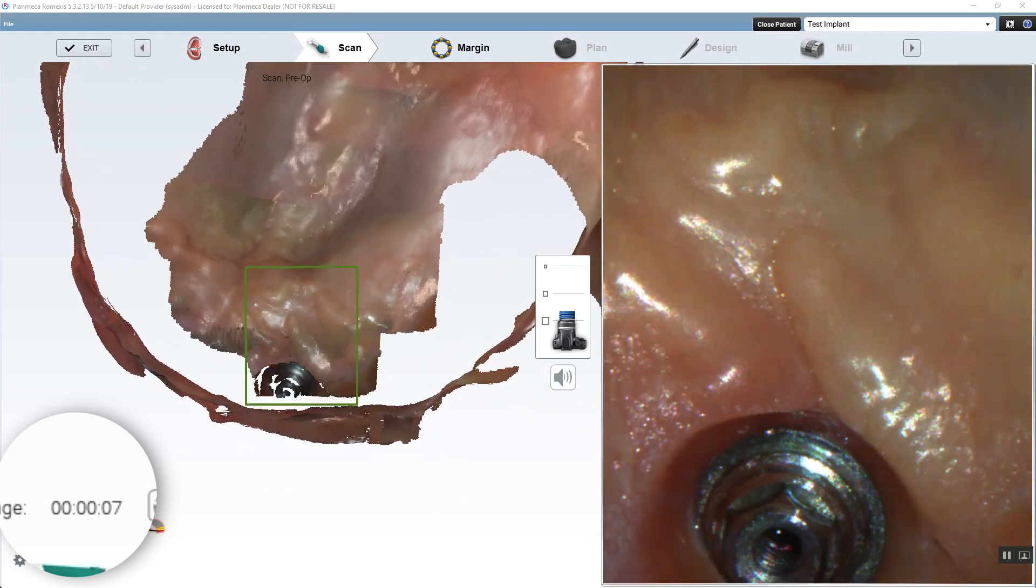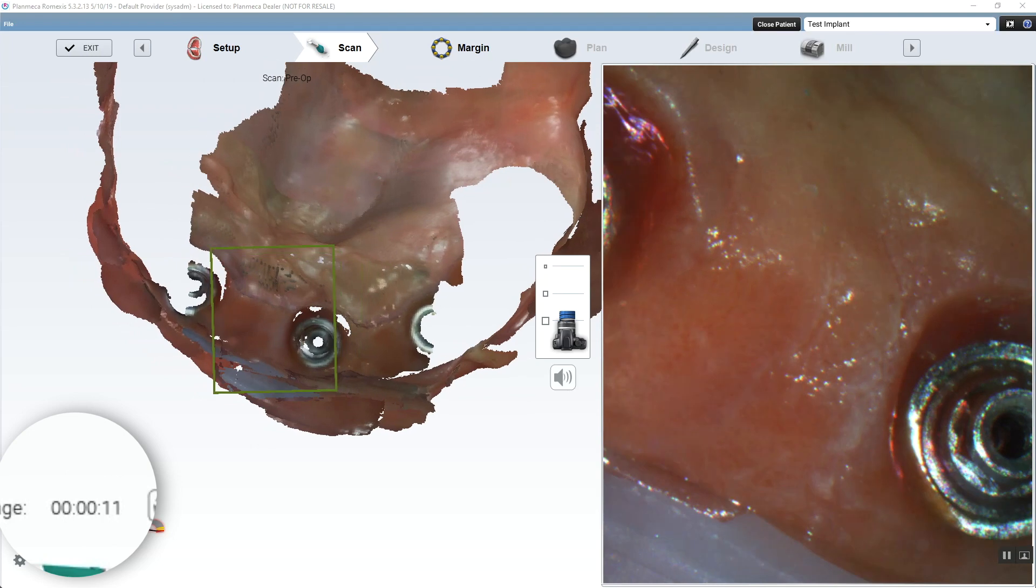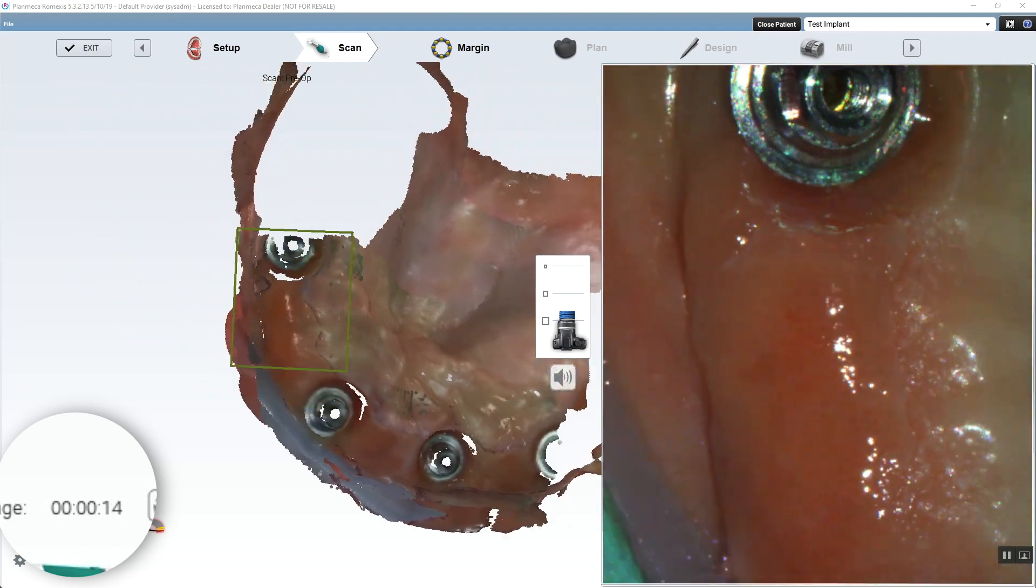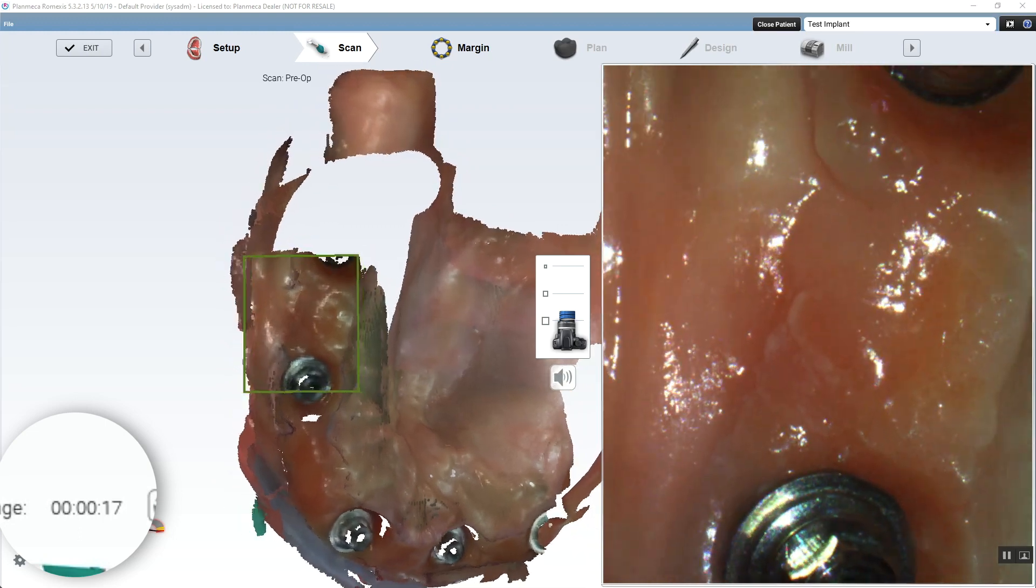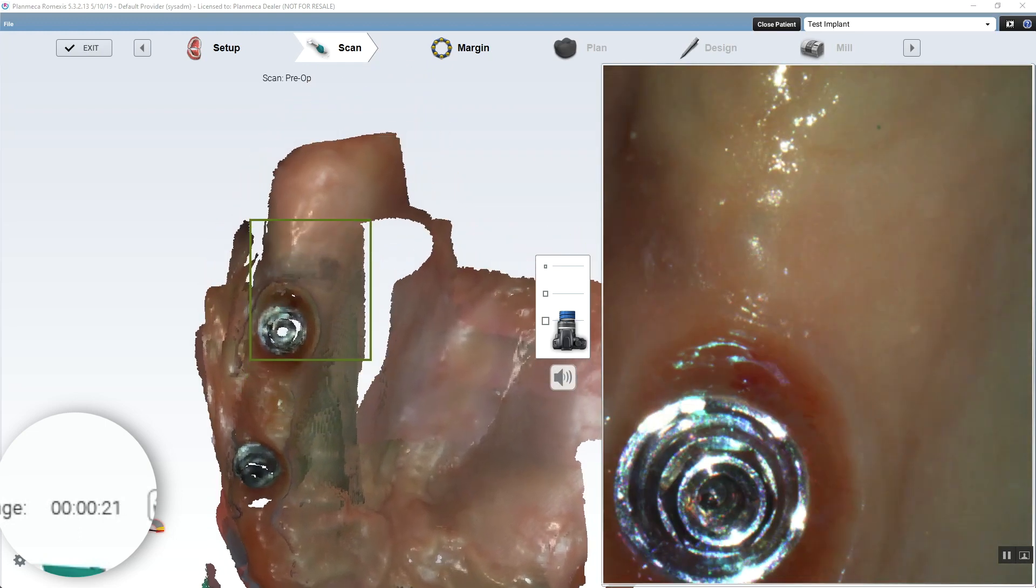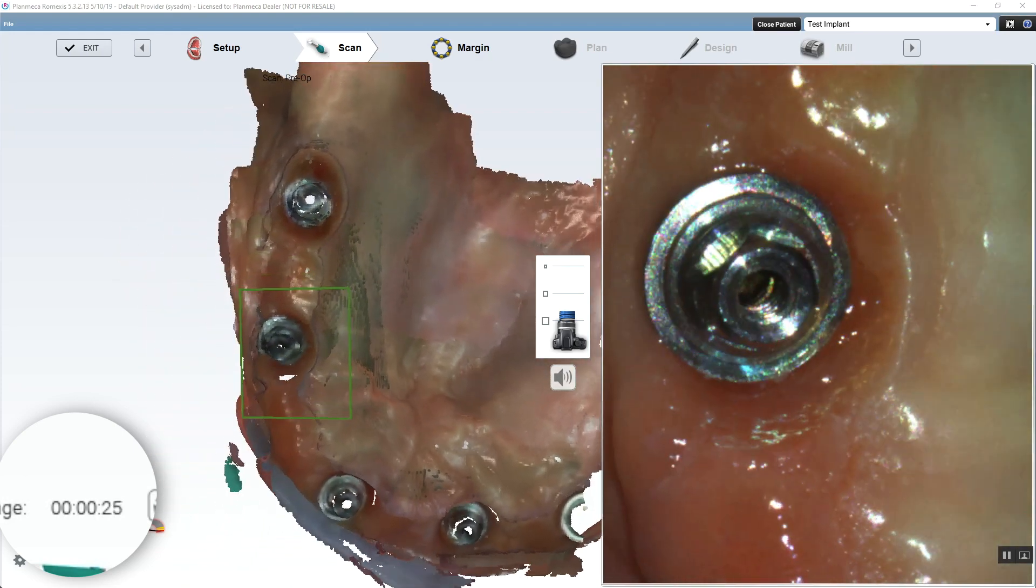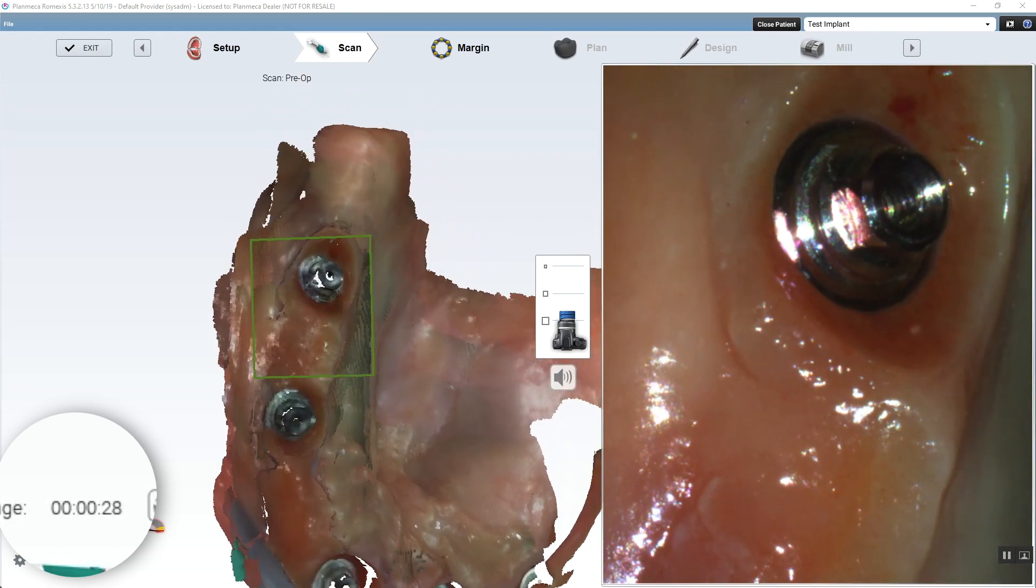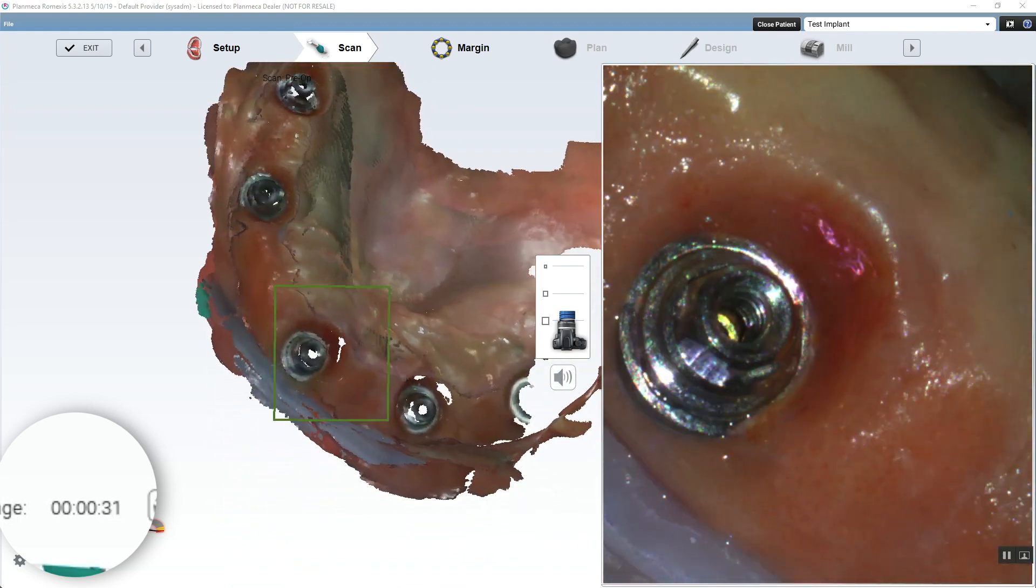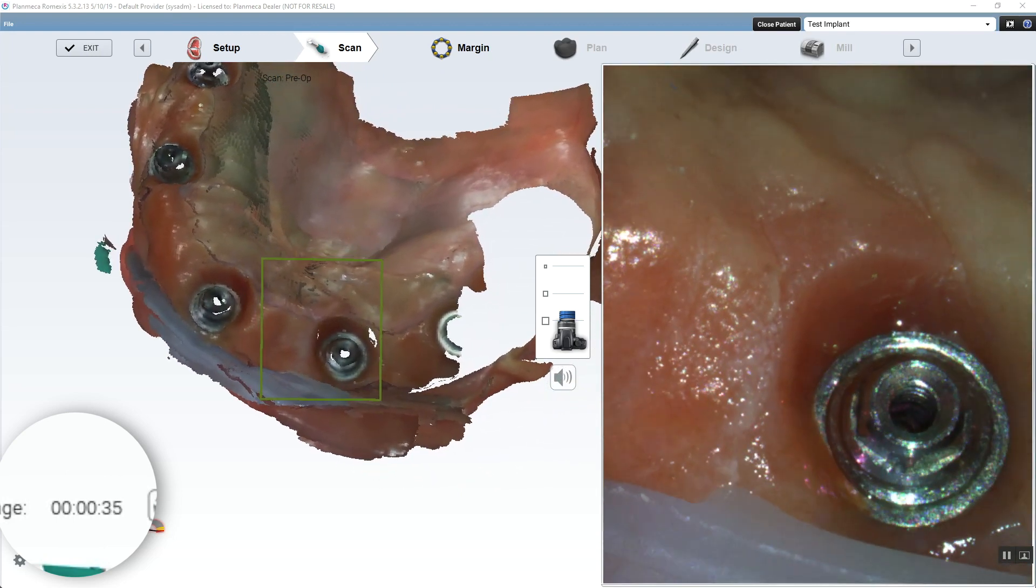And now I'm going to just kind of slowly work over to these little multi-unit heads, abutments. And I'm going to scan those in for a soft tissue scan. This is not where you want to be super fast and cool with your scans. You kind of want to slow it down here for accuracy sake. Let it fill in. Just kind of do slow little rolls. Try not to jitter and jump around a whole bunch. Just let it take your sweet time.